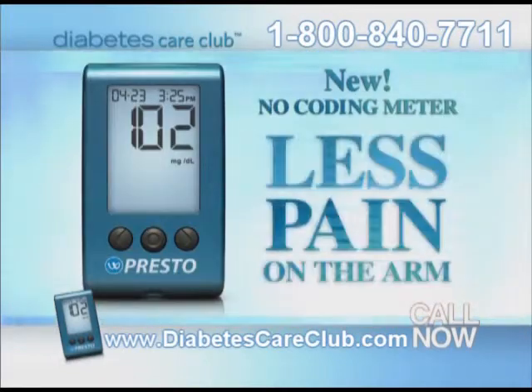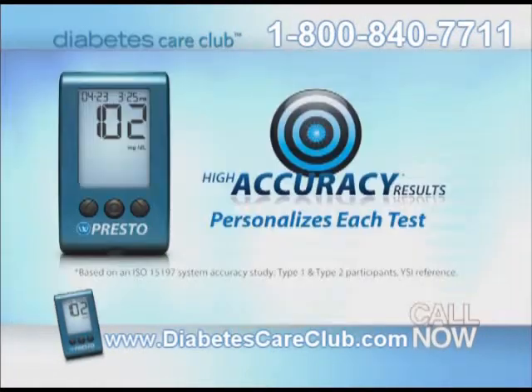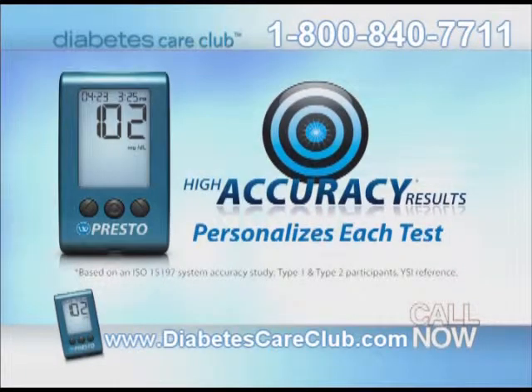You don't have to code your meter anymore, and you don't have to stab your fingers. These new no-code meters are easier to use and nearly painless. This new method hurts less, and I don't have to code the test strips anymore. No-coding helps make testing faster and confirms accuracy.